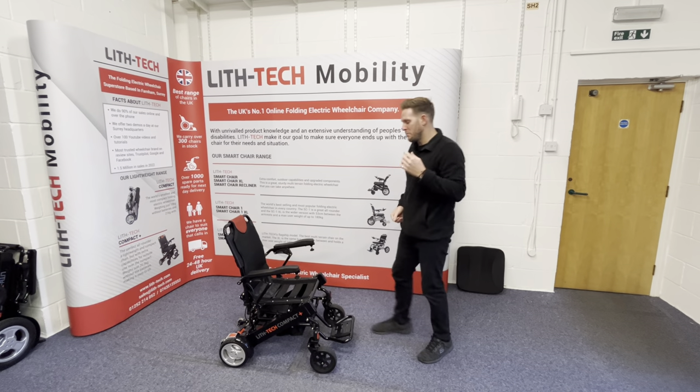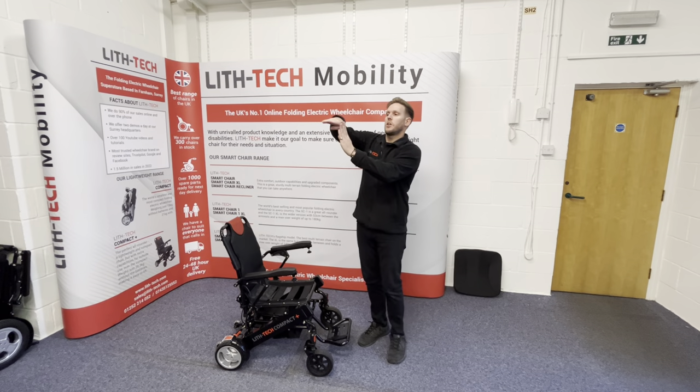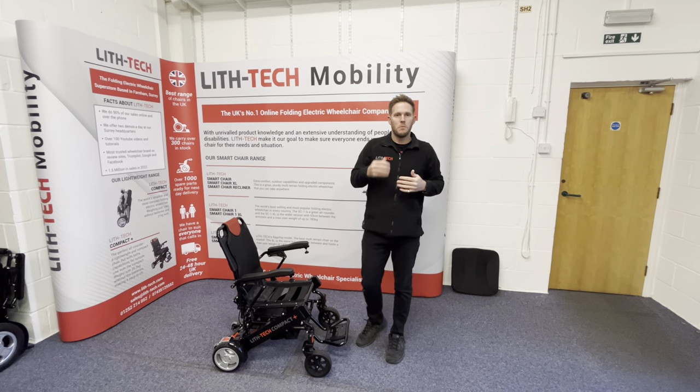It's going to be much smoother, much safer, much more comfortable. When you're climbing curbs, rather than bashing into them, what will happen is the wheels will compress, the suspension will compress, and you'll gently climb the curb. So it's going to make everyday outings much, much smoother.